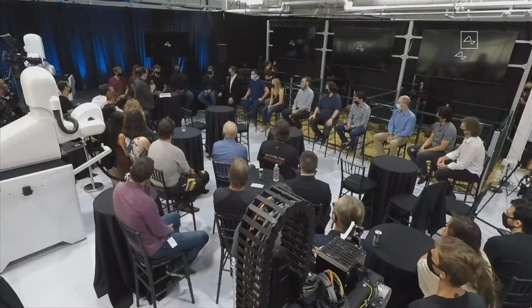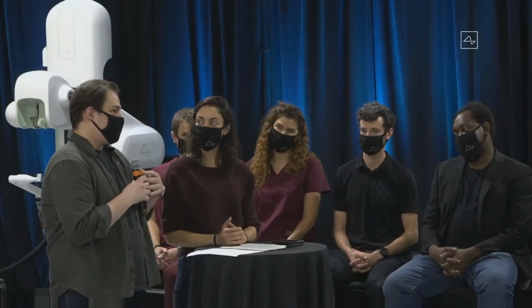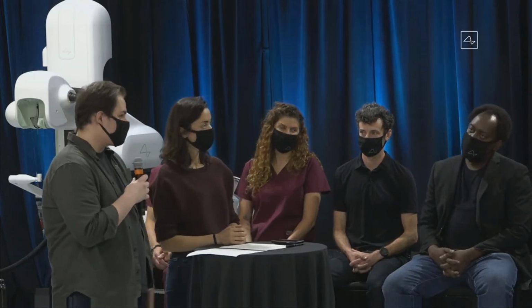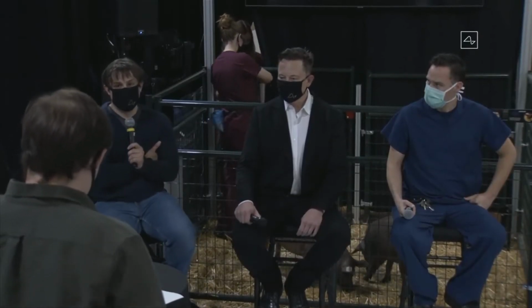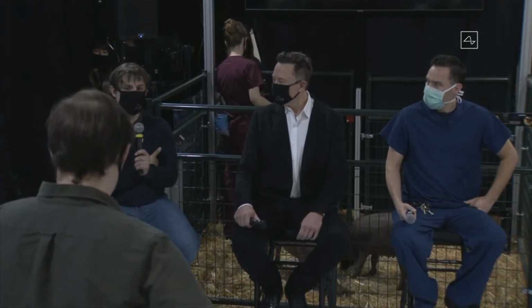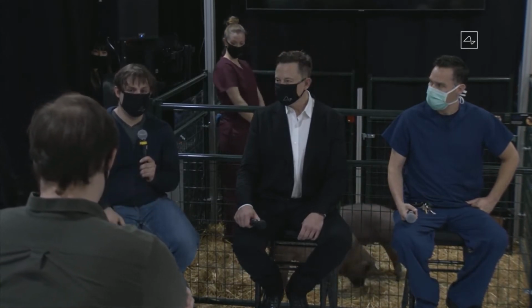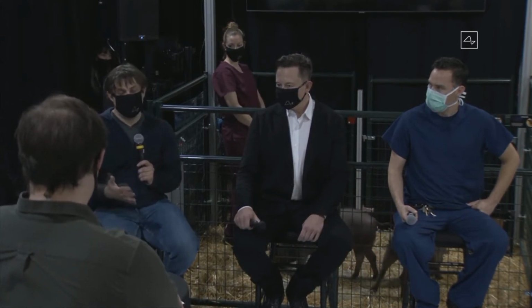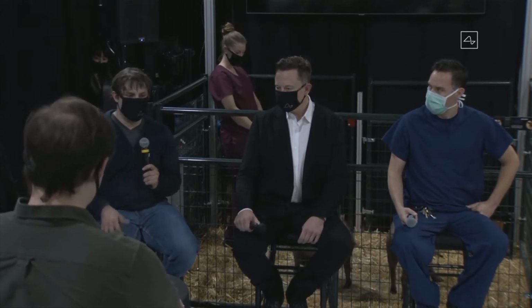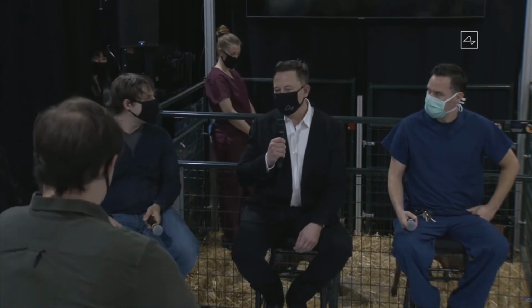Actually, Max, this might be a question for you. Some of the questions we had on Twitter was, how do you see the Neuralink device and the essentially API growing over time and allowing developers to interact with the device? There are interesting questions long term about whether you do decoding on head or on a phone or on a computer. At 1,000 channels, it's possible to send all the spike data to a phone and do processing there. As this gets bigger and bigger, you're going to be more constrained by the radio, so you're going to want to push more of this on head, and that changes your programming model. But really, the APIs you're getting either bin spikes, or you're getting raw waveforms, and you can consume it basically like an audio feed. It's worth noting, the lossless compression of the data stream is about 100 kilobits with 1,024 channels.